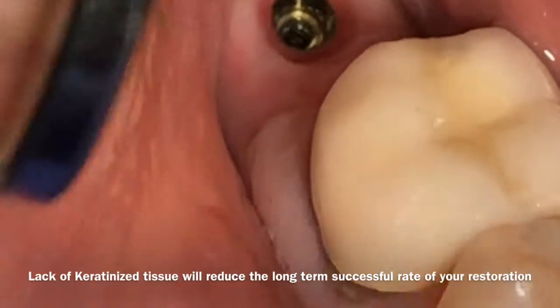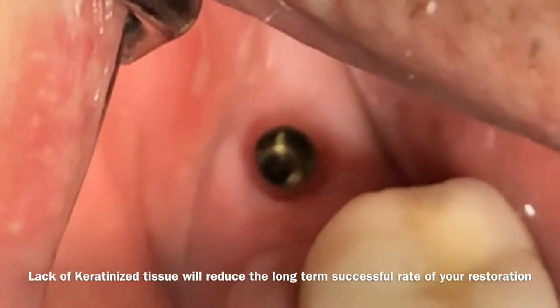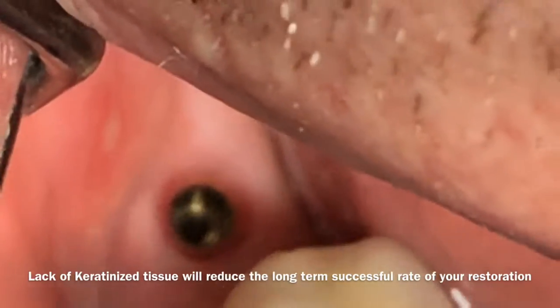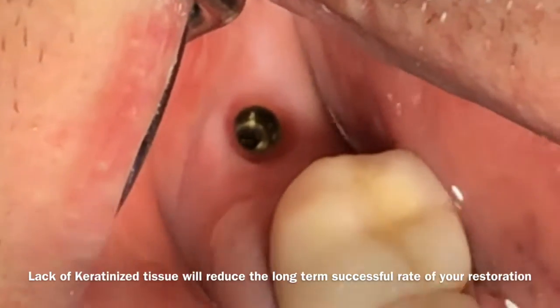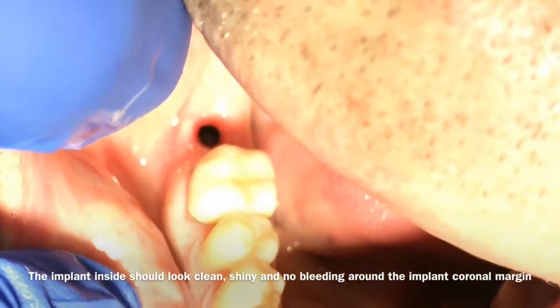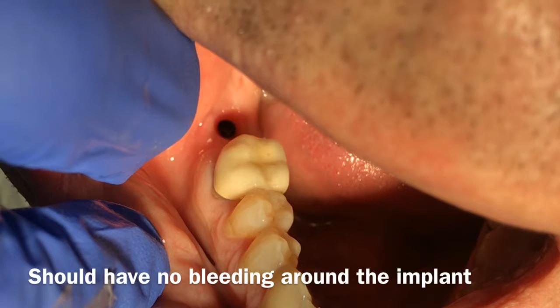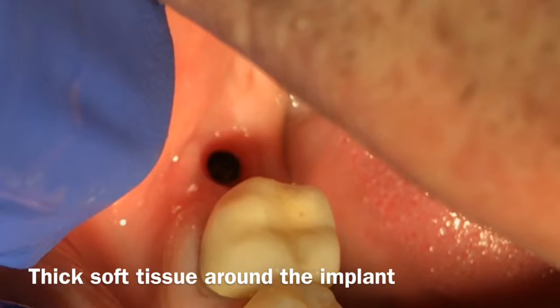In this case, you can see the way it looks — it looks very solid. There is no bleeding around the implant, and the inside looks shiny. That is how you get ready for taking the final impression for the crown. What you are looking for is no bleeding around the implant and no bleeding around the soft tissue.